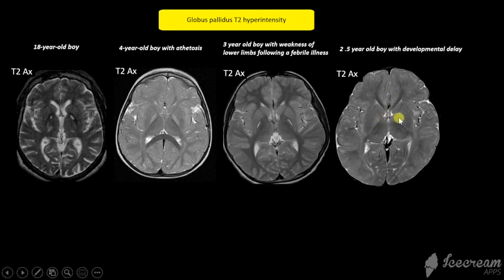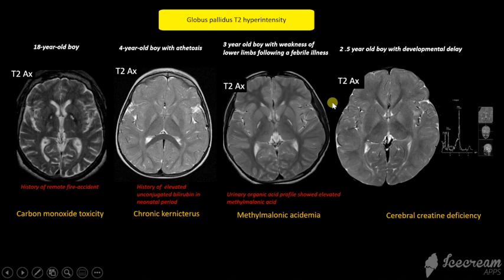This child has fuzzy changes involving the globus pallidus and a background of delayed myelination. MR spectroscopy was very useful in this case, which showed an absent creatine peak at 3 parts per million. So this is creatine deficiency.